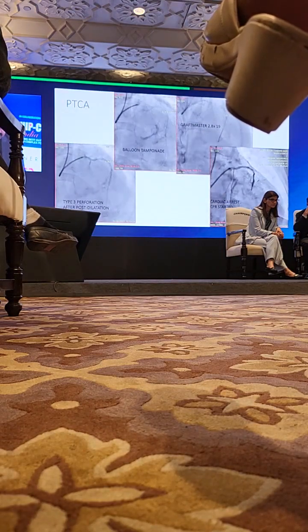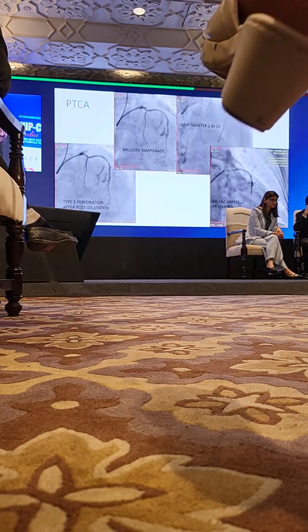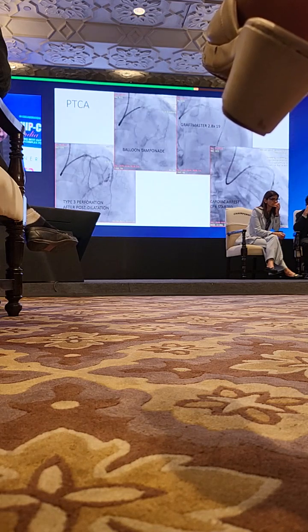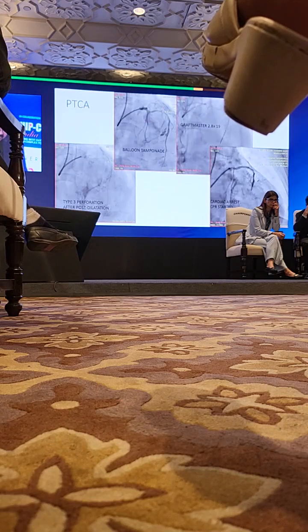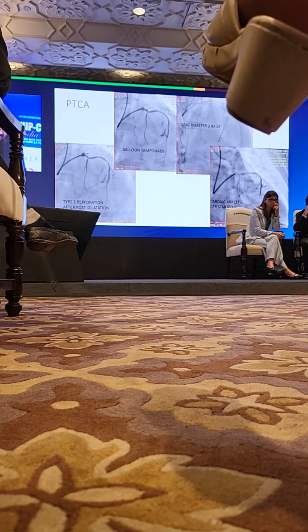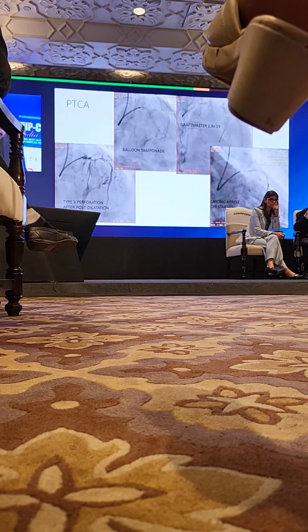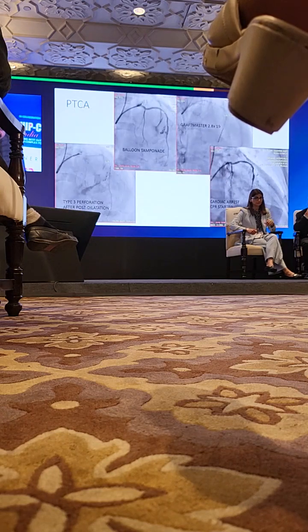So you have to post dilate, but as I was post dilating, you can see there is a type 3 perforation. Immediately after the type 3 perforation, hypotension started. Did the balloon tamponade by putting the balloon just proximal to the lesion, and then immediately took the graft master. 2.8 into 19 graft master was taken.